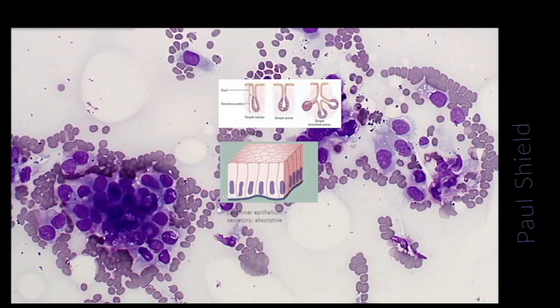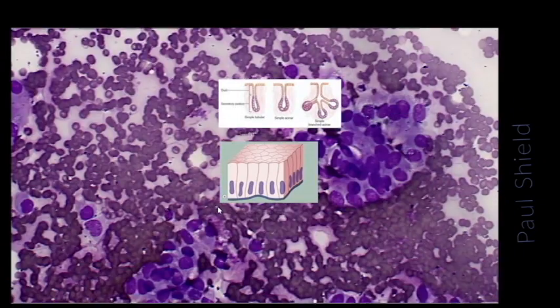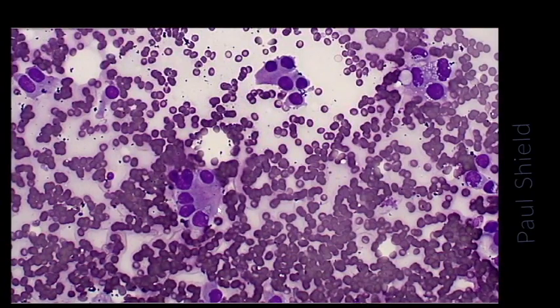And so they've got columnar shapes, and sometimes you even see these acinar glandular arrangements. Looking at these cells, you can see there's more of that cytoplasmic vacuolation, and this group here is interesting. So the nuclei are all arranged on the outside with the long ends pointing to the middle.